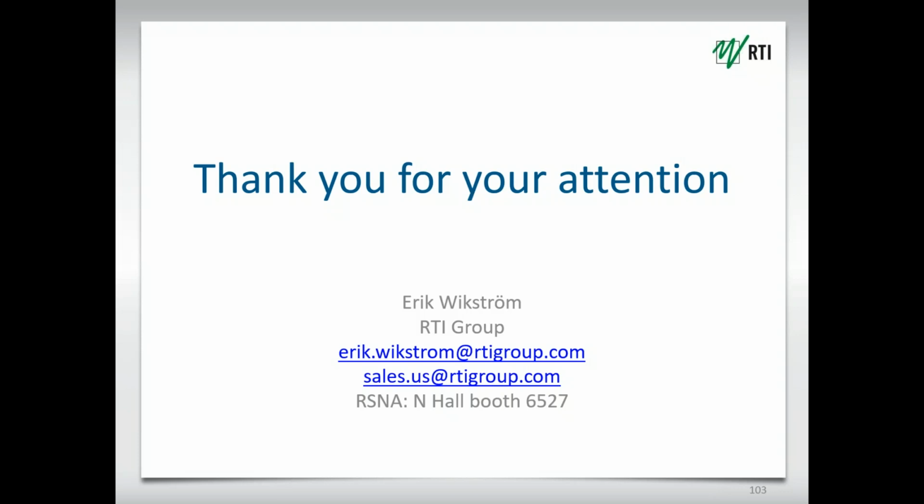So, has this been used in the field at all? Oh yes, we've got many customers working with it. Of course, all customers use the Ocean Quick Check because that's what comes with the instrument. But we have many customers also using the Ocean Professional once they understand the benefits and the efficiency gains that they can get from customizing their own QA procedures.